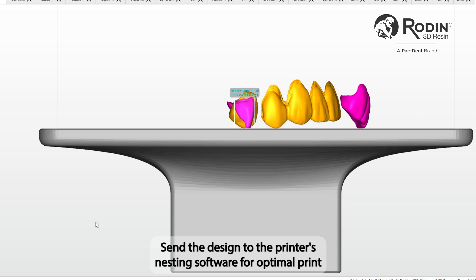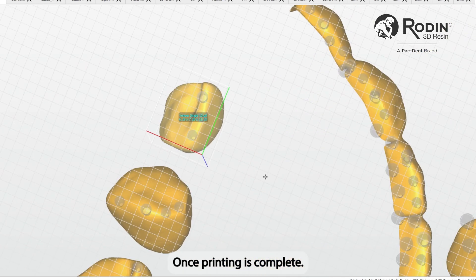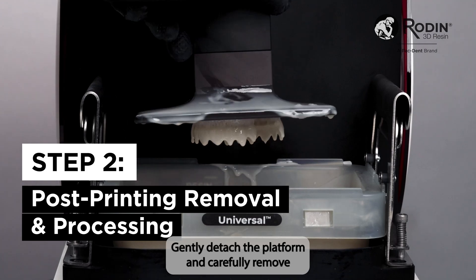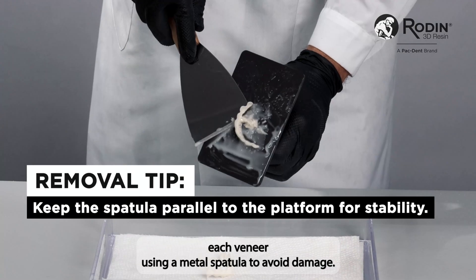Send the design to the printer's nesting software for optimal print layout and begin the printing job. Once printing is complete, gently detach the platform and carefully remove each veneer using a metal spatula to avoid damage.